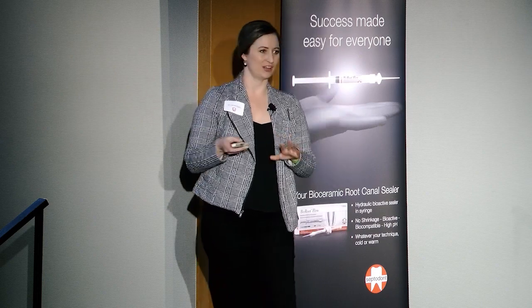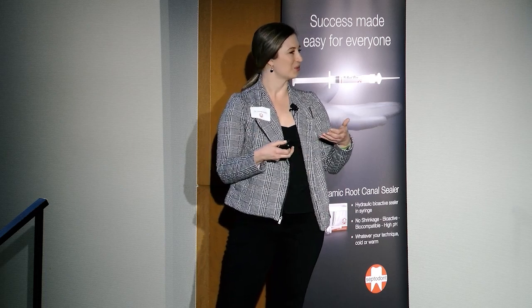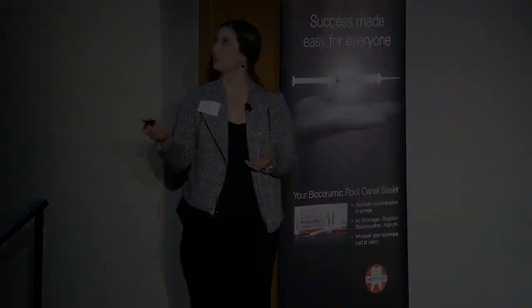Single cone technique was kind of a pipe dream, like if I could just stick some sealer in there, shove a gutta percha in, wouldn't that be great? That would just make everybody happy. But the problem is sealers shrink. There are voids everywhere, and this is not really creating the seal that we need. So all of this has created a lot of challenges in endodontics.